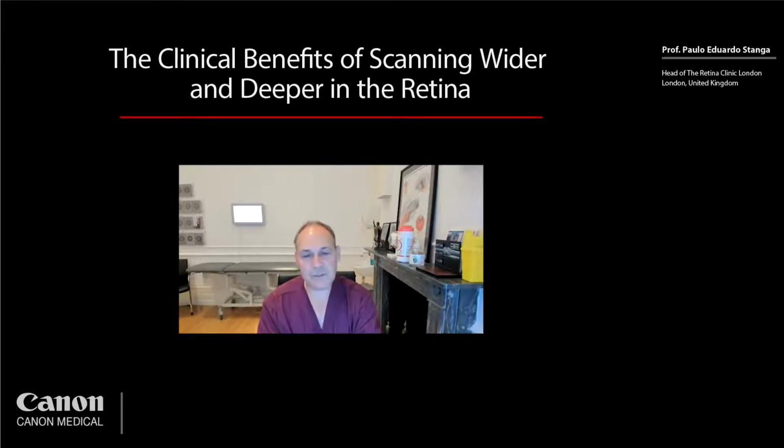Sandrine will present on the feasibility and clinical utility of ultra-wide field OCT angiography. Sandrine, thank you very much for joining us.